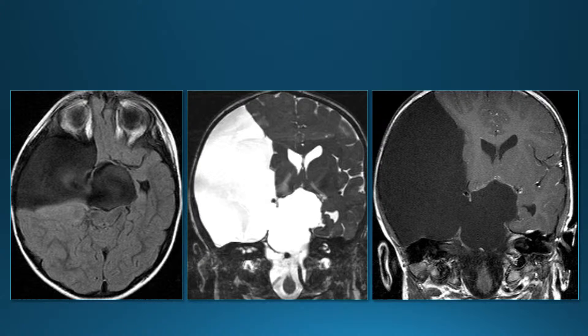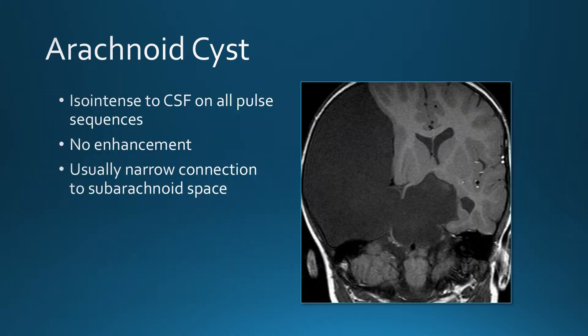There's a large cyst iso-intense to CSF on all pulse sequences — typical appearance of an arachnoid cyst. The key here is they're iso-intense to CSF on all pulse sequences, with no enhancement. They typically have a narrow connection to the subarachnoid space, so if you instilled contrast through a myelogram they would not fill immediately but would fill with contrast over time.